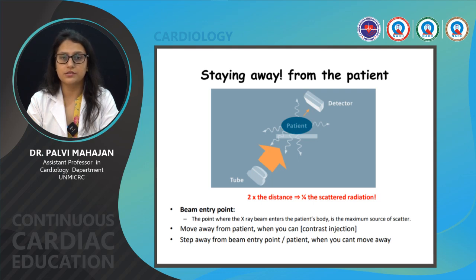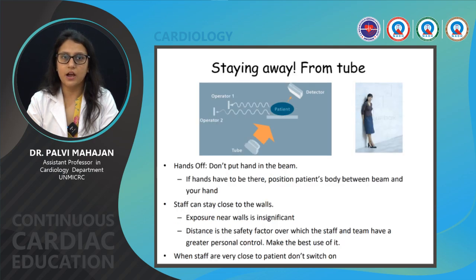Example, during the contrast injection. Step away from the beam entry point when you can. Stay away, hands off. Don't put the hands in the beam. If the hands have to be there, position the patient's body between the beam and your hand.